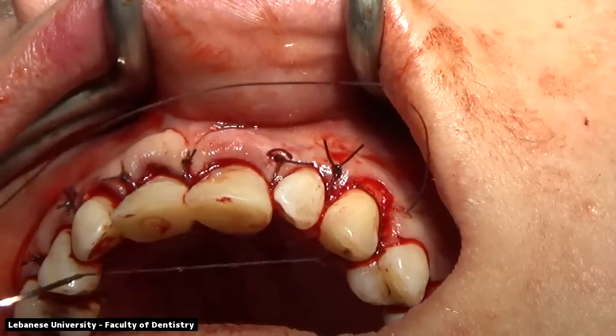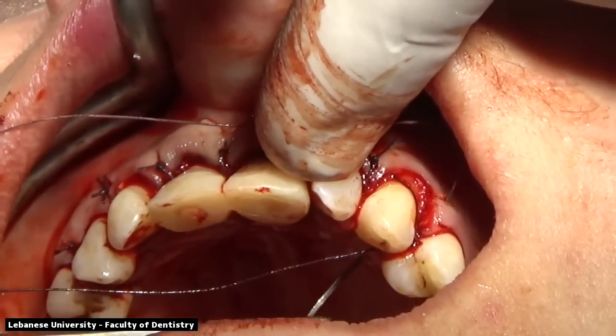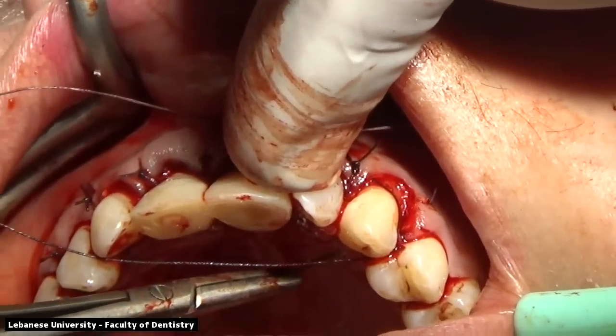Placing the last suture in between the canine and the premolar, going at the base of the papilla again, about 4 to 5 millimeters away from the margin, going underneath the contact area to the palatal aspect and engaging the palatal soft tissue.